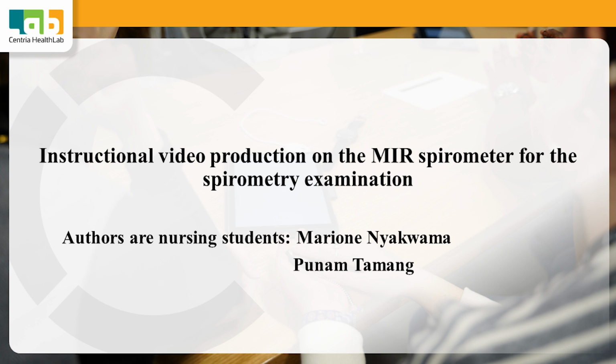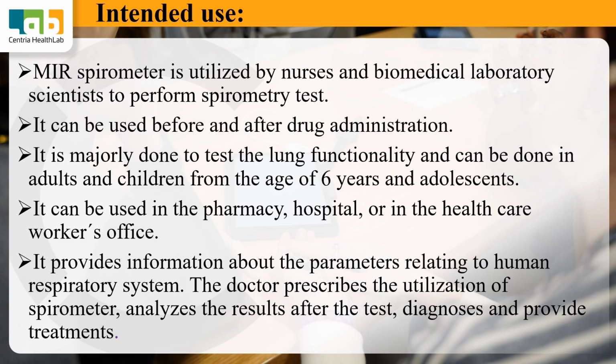for spirometry examinations. Intended use: MIR spirometer is utilized by nurses and biomedical laboratory scientists to perform spirometry tests. It can be used before and after drug administration. It is majorly done to test the lung functionality and can be done in adults and children from the age of 6 and adolescents. It can be used in the pharmacy, hospital, or in the healthcare worker's office.